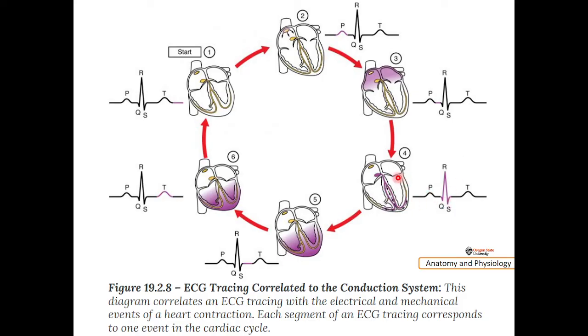And later a wave is here when the base of the heart is activated, or electrical activity reaches the base of the heart, opposite to the direction, or away from the direction, of the cardiac axis, so it creates this S, which is a small s.